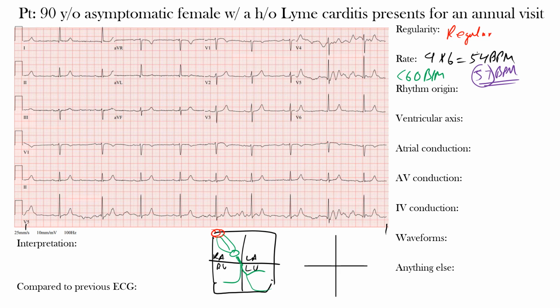So when we look at sinus rhythm, we want the rhythm to originate from this SA or sinoatrial node, and notice that it heads in this direction to that AV node. You also have that Bachmann bundle coming to the left side, but in general, the main depolarization pathway is heading in this way. So if you were to superimpose the right atrium on this, imagine this is our right atrium, meaning we're taking this right here and placing it over this, that would mean that our sinus node will be placed there, and you have our internodal pathways coming, and imagine our AV node there.